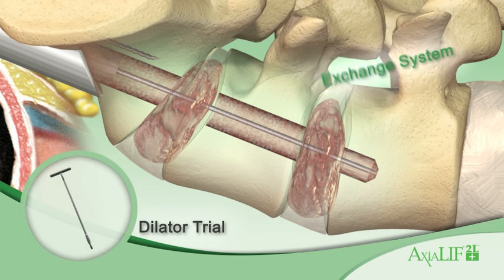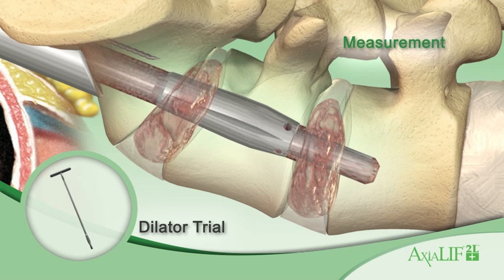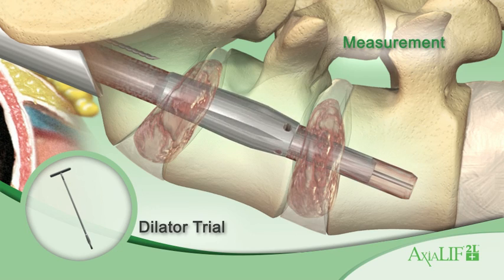Insert the selected dilator trial over the guide wire until it is advanced into the L4 vertebral body. From this placement, determine the L4-L5 rod and S1 anchor sizing.